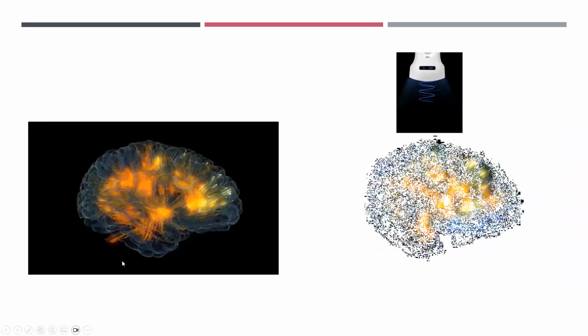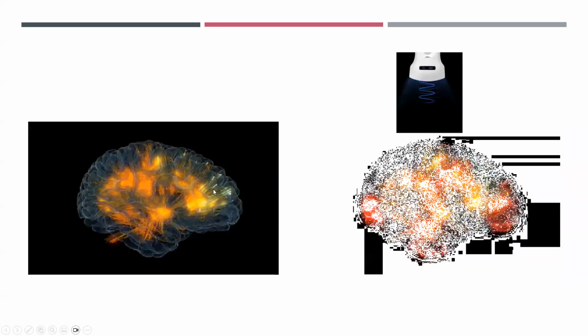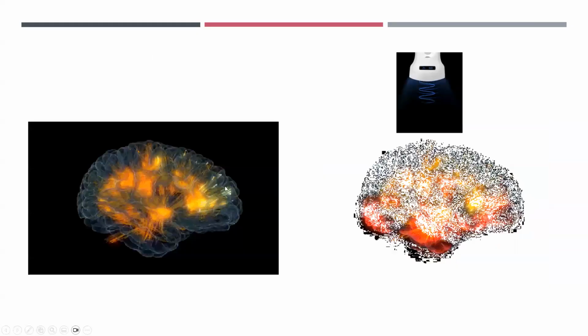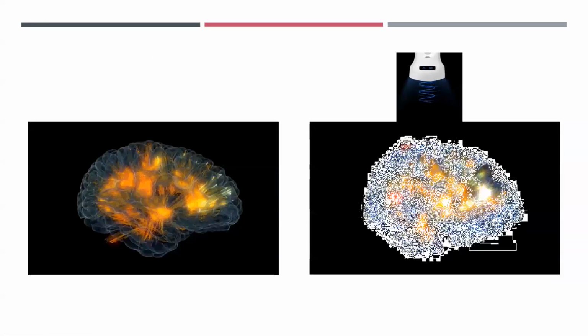So really, what is happening to the ultrasound wave when it actually interacts with the brain? As I told you, superficial areas of the brain, which have a lot of tissue, will tend to reflect back. So you will basically, from your perspective, see these areas much better with a high frequency probe. On the other hand, deeper areas of tissue will tend to absorb and attenuate. And for that reason, often the slightly deeper areas of the brain tend to appear slightly darker.